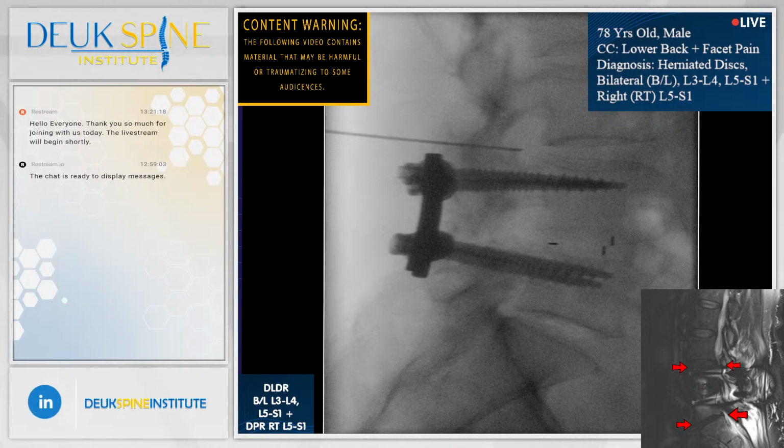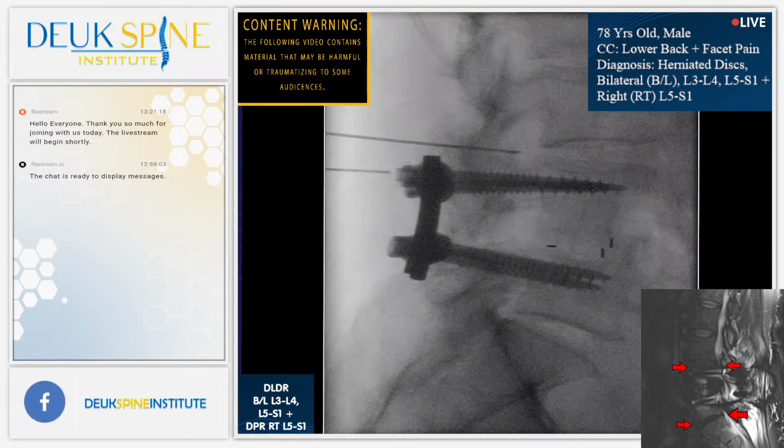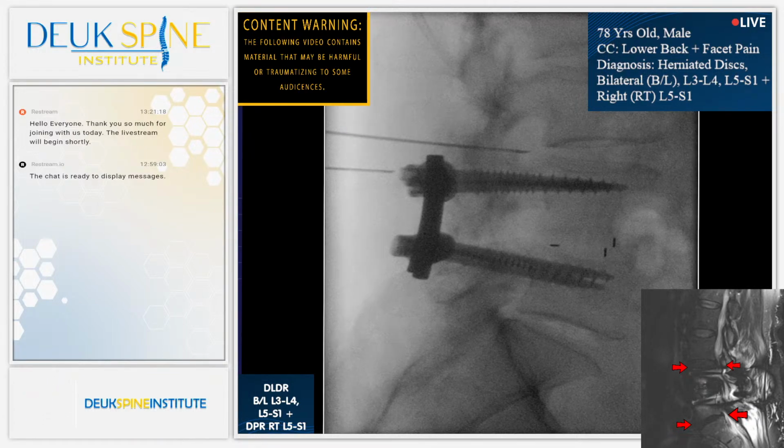Here it is. All right, perfect. So, I'm just giving him a little numbing medicine here. All right, so we are in excellent position with the left needle. I'm going to enter his tear.